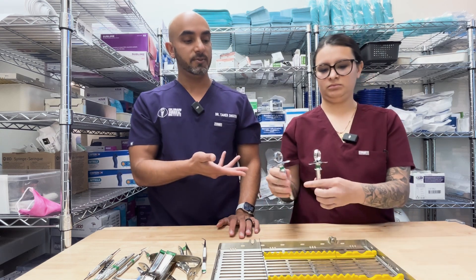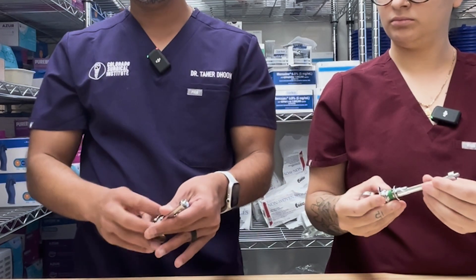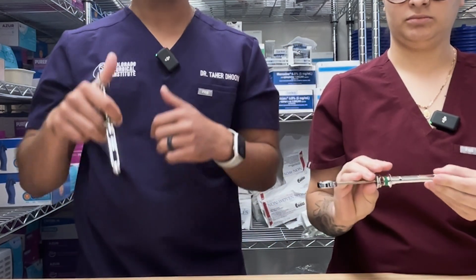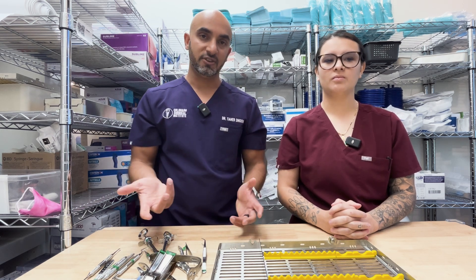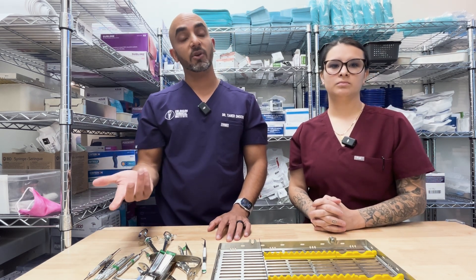We always have two anesthetic syringes. I'm over here injecting, Makayla's reloading, then I hand it back to her and she hands me the fresh one — we do-si-do so I can deliver the anesthetic as quickly as possible. If the patient is deeply sedated, I'll actually go heavy-handed with the anesthetic because it creates a stimulus and the anesthesiologist can see the patient's reaction. So you don't have to go low and slow if the patient is sedated. If the patient is not sedated, still anesthetize slowly as we were taught. But sometimes you want to stimulate the patient to see a response on the monitor, and delivering the anesthetic quickly is important for that.